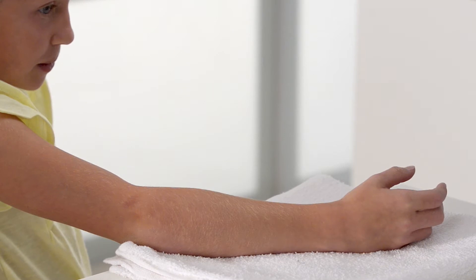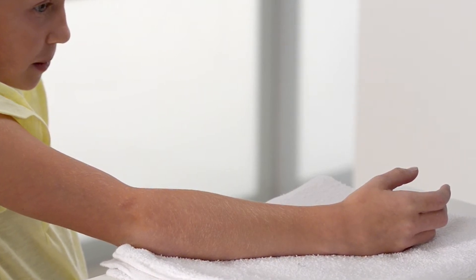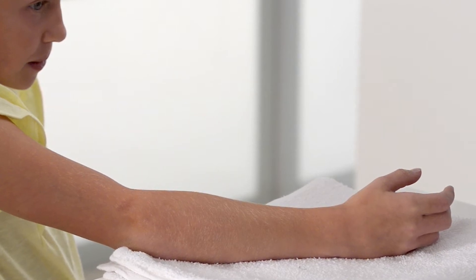Unless otherwise indicated, the wrist and hand should be placed in an anatomically neutral position, while the index finger and thumb should be in opposition, allowing for functional hand movements.